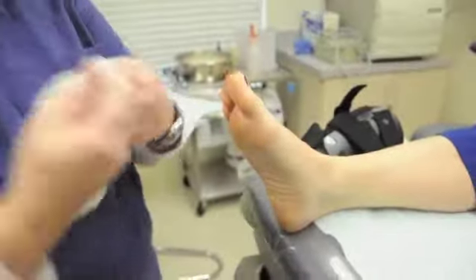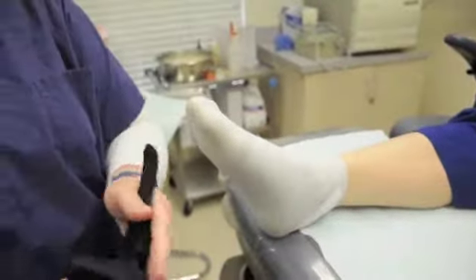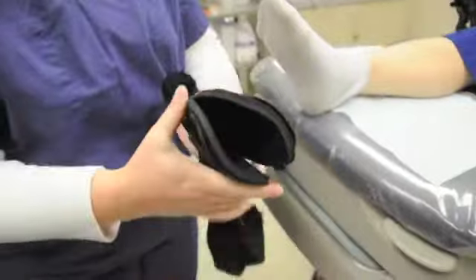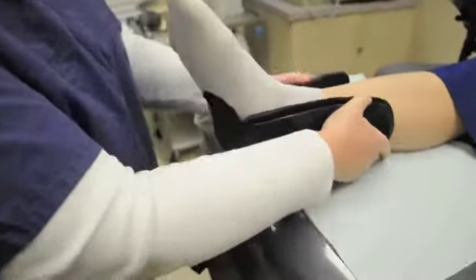First things first, always, always, always put their sock on first. They must wear a sock with it — they cannot wear it without a sock. It is preferable that they wear a sock that is tall so that way it doesn't rub the tops of their calves.